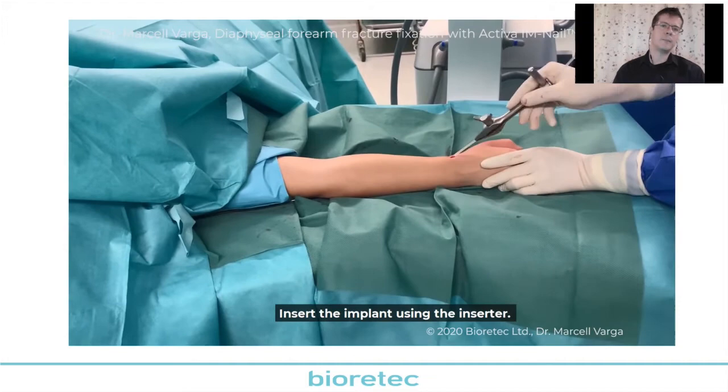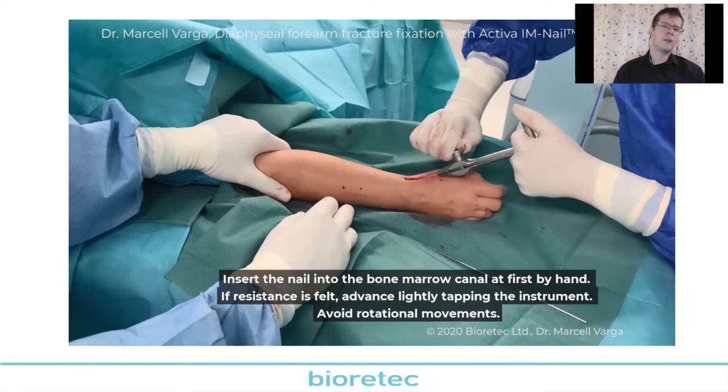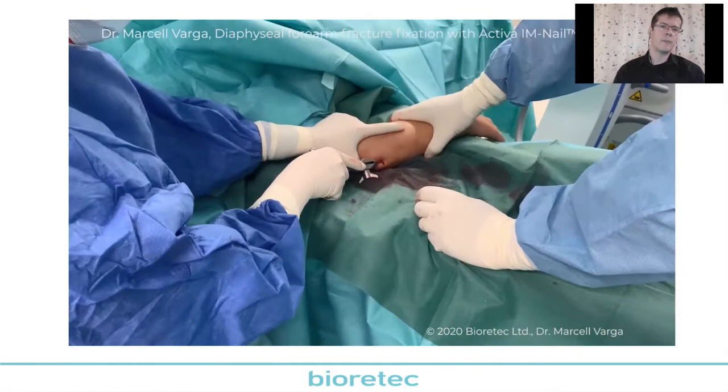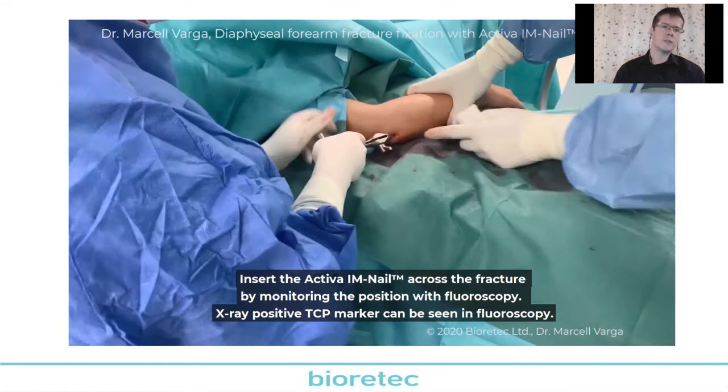Here we can see the technique. In this state of the operation, I don't have the possibility to hammer it. The nail should slip very easily, without any problem, through the medullary canal and through the fracture. Here we can see as the nail is on the ulna side, I take it forward and it should slip without any problem, without any barrier.